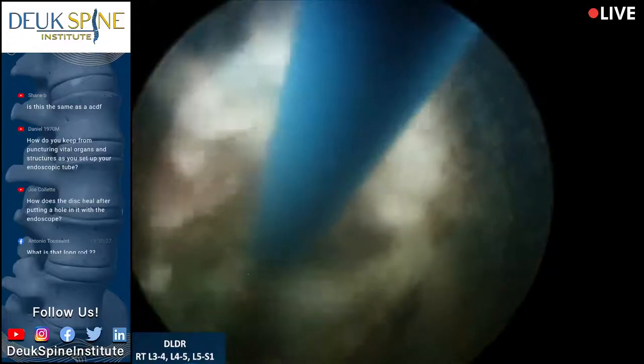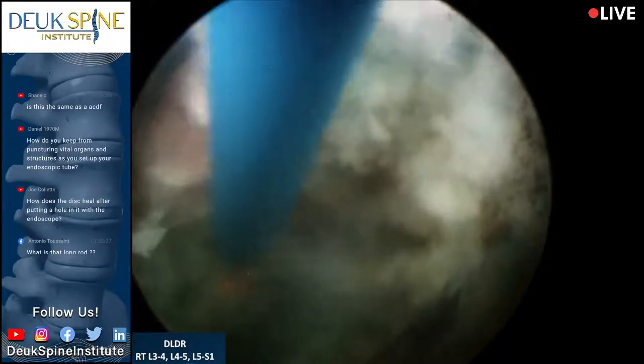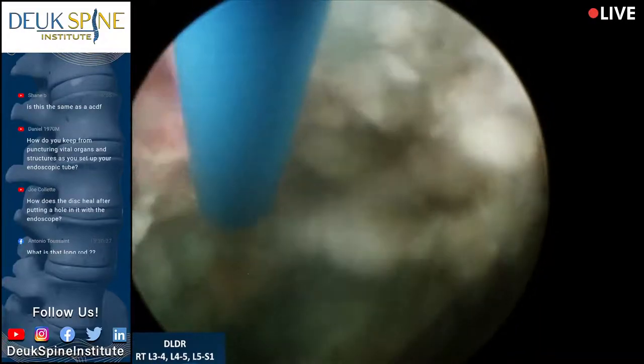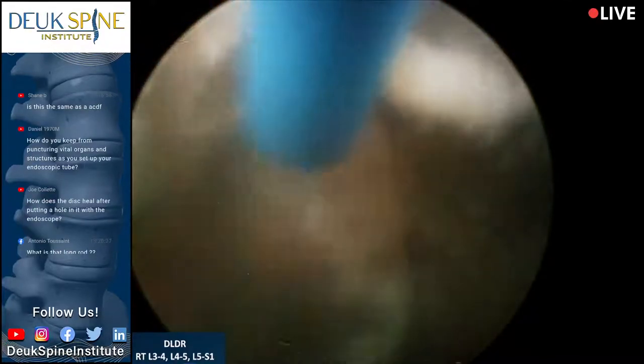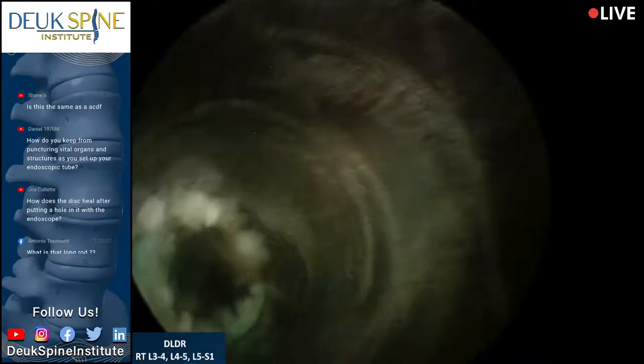I have to say, of all the discs that I fixed on this patient, this one, to me, is the most damaged, the most disrupted. And it looks like a lot of it's at least 5 years old, maybe longer. So this is something that's been going on for a while in this patient.